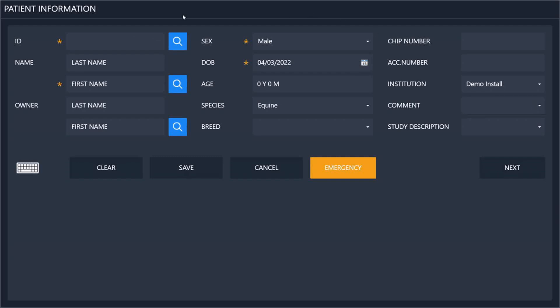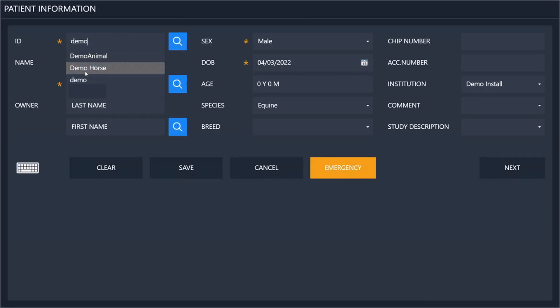The software remembers your previous patients, and if you enter one that you have done before, it will look up those previous ones and simply fill in the information for you when you select them. You can also search by the first name of the patient and the first name of the owner.